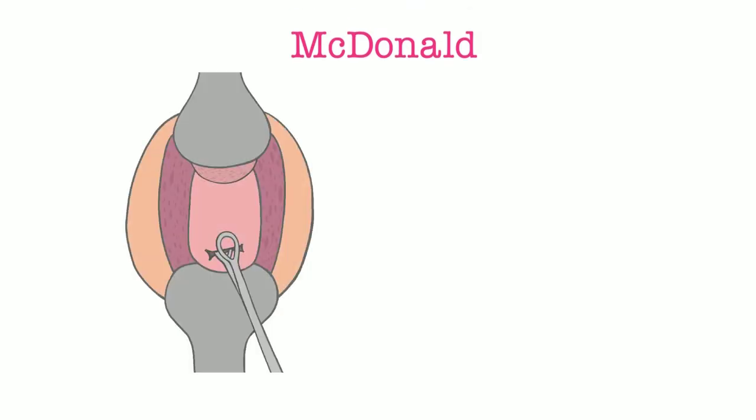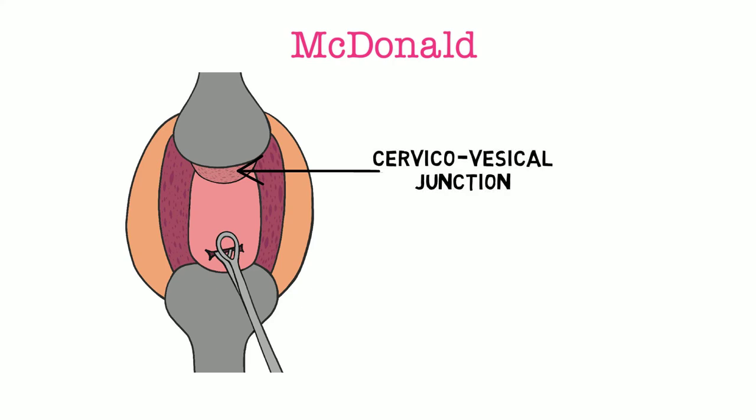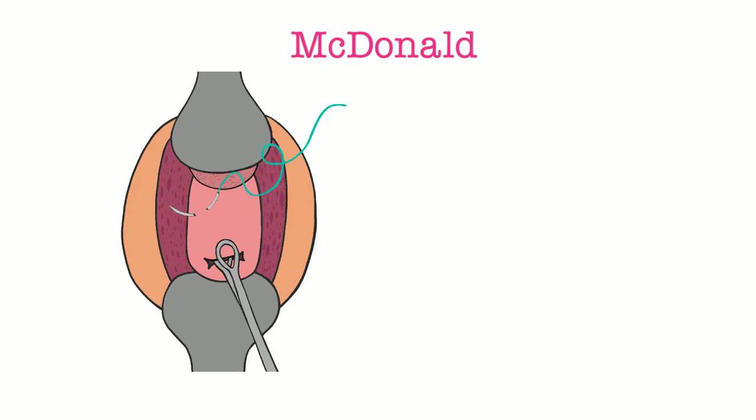The McDonald Cerclage — a reminder from anatomy. With outward retraction of the cervix, you can identify the cervicovesical junction where the bladder reflects onto the anterior edge of the cervix. When inserting your needle, the goal is to start as anteriorly on the cervix as possible without injuring the bladder, using this junction as your guide.